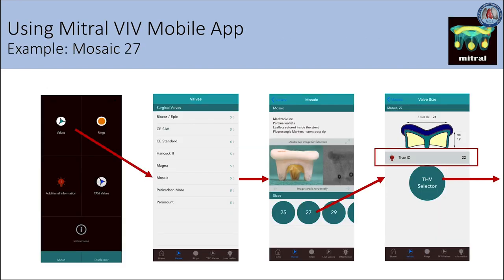This slide demonstrates the mitral valve-in-valve app functionality. Starting with the leftmost panel, once you open the app, you can click on valves and select the specific type of valve in your patient — for example, Mosaic. Once you select your valve of interest, the app provides information about the valve and you may then select the size. In this example, we selected size 27, which directs you to important dimensions such as the true ID. There is also a link explaining the true ID concept in greater detail, and you may select the transcatheter heart valve selector.